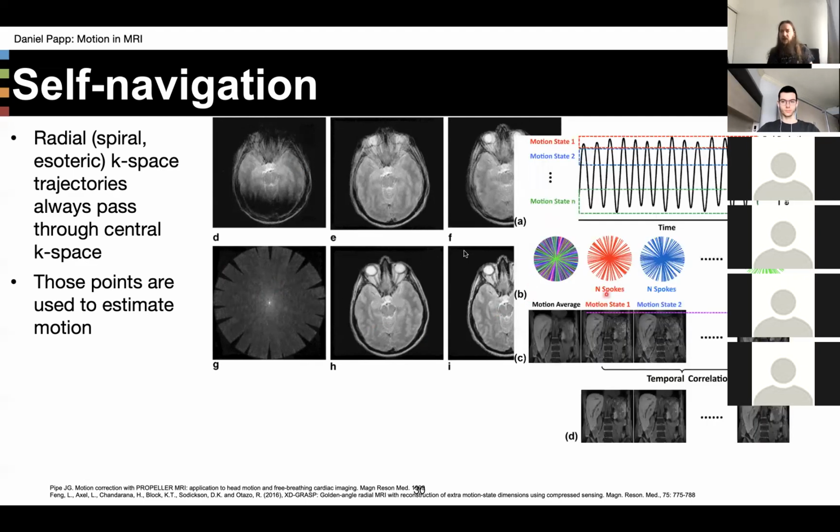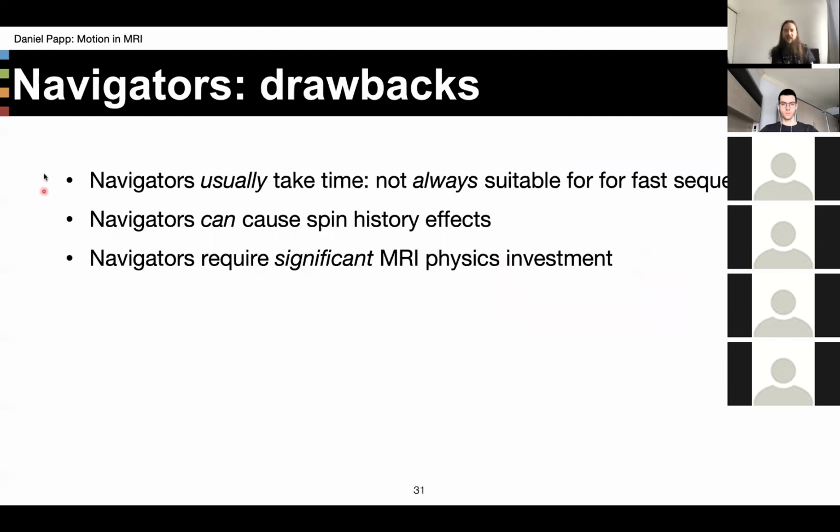Or if you have some of these sort of golden angle arrangements, that just means that there's an optimal way to stagger spoke 1, spoke 2, spoke 3, etc., around k-space to get you both temporal and spatial resolution, and you can work out a lot of information from these, but I don't want to go too much in depth.